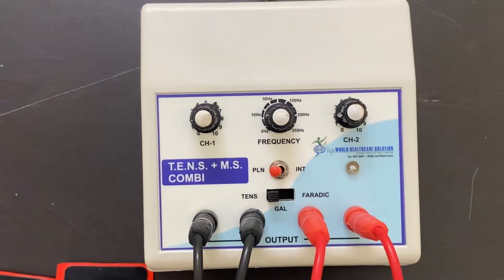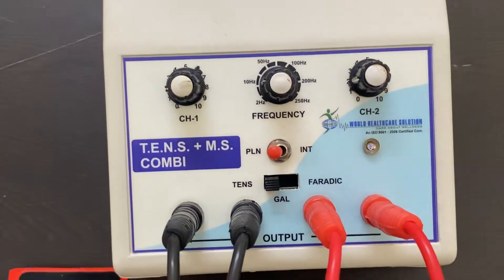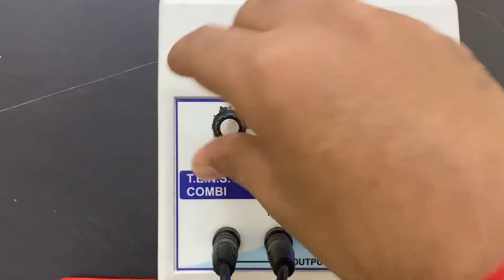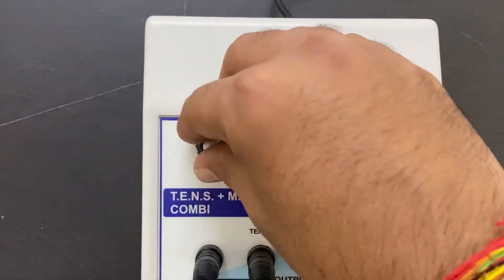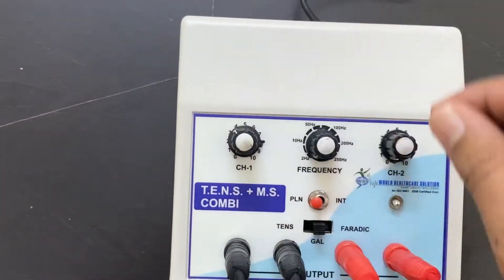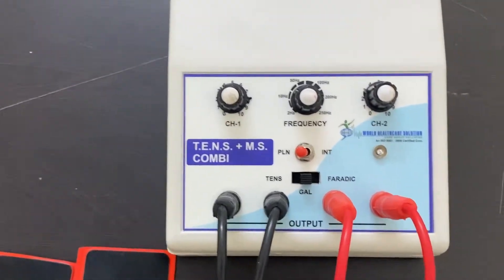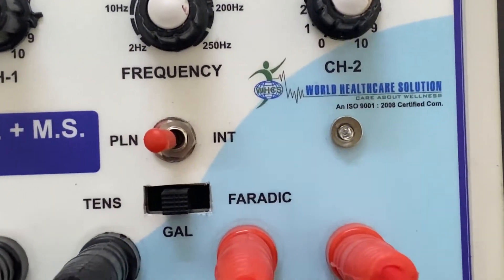The demonstration for TENS is completed. Let's begin with galvanic mode, which is the muscle stimulator. First, turn the knob off, then set the mode to galvanic. Again, set the intensity and set the frequency for both channels. The machine is now ready to use in galvanic mode.